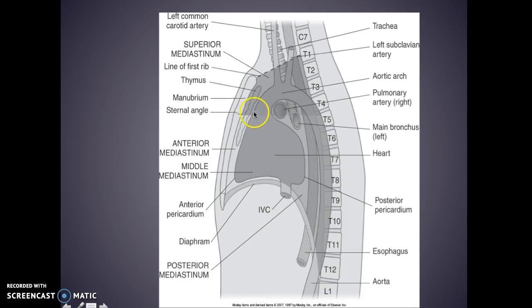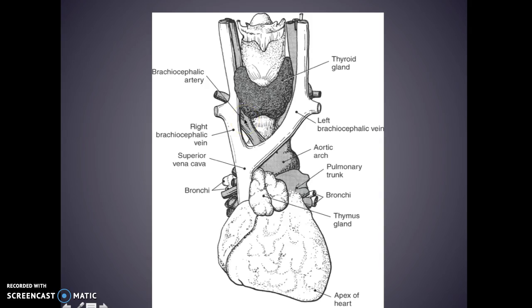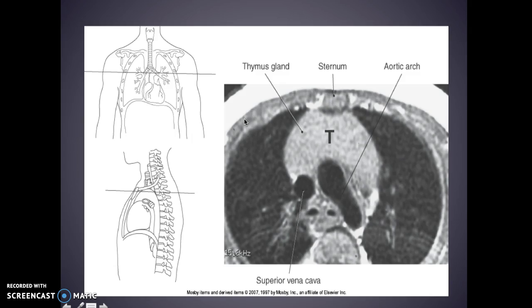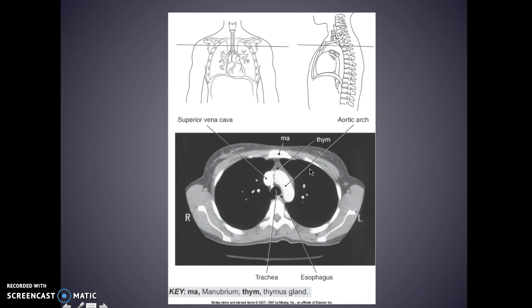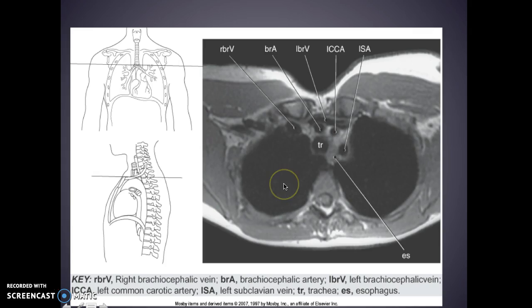Looking at it here versus here gives you an idea of where the thymus sits in the mediastinum. This is an enlarged thymus — this patient clearly is having some issues with their thymus. Manubrium, your thymus is there, your esophagus, trachea, aortic arch, and your superior vena cava.